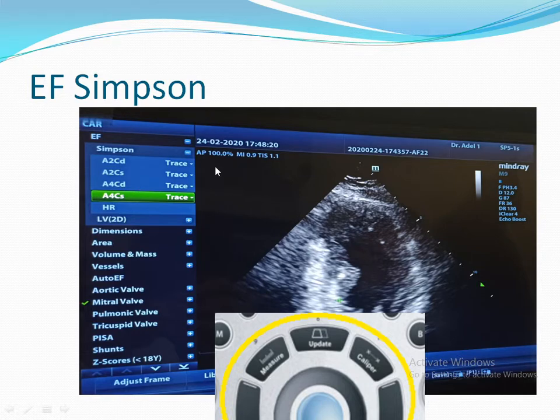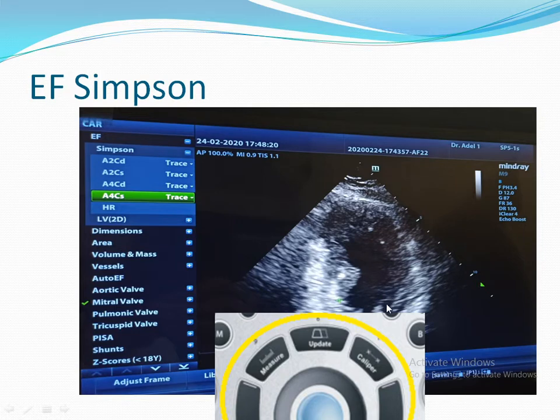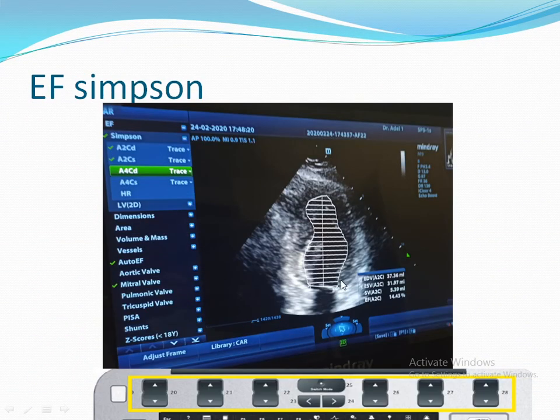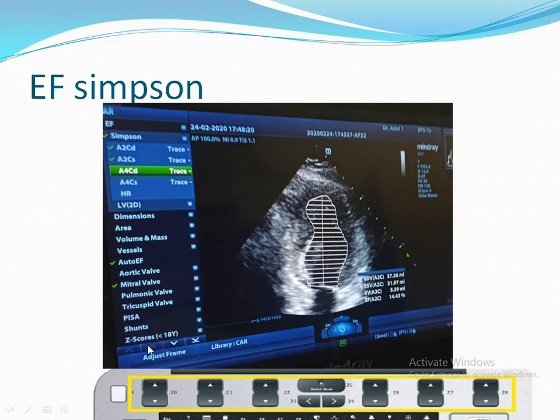Press Measure, then choose Ejection Fraction — Simpson's apical 2 or apical 4 according to your view. For apical 2, we will start from diastole — trace from here and complete the measurement to here. The machine will automatically transfer to the apical 2-chamber systole view. You can change the frame using the frame adjustment button on the keyboard, then measure again from here to here to get the ejection fraction by Simpson's. This can also be done on the apical 4-chamber view.